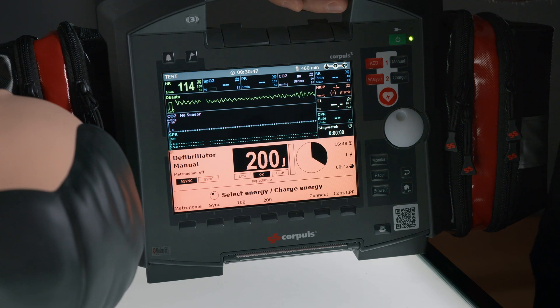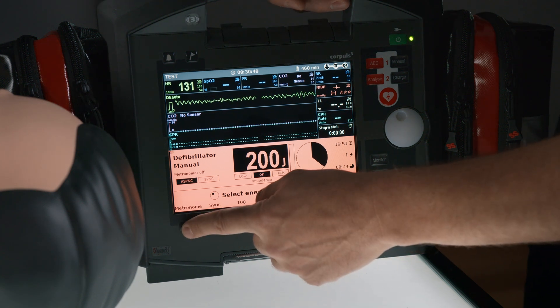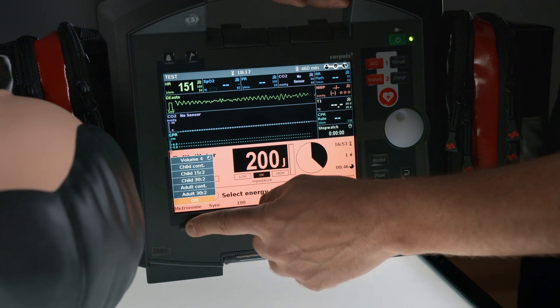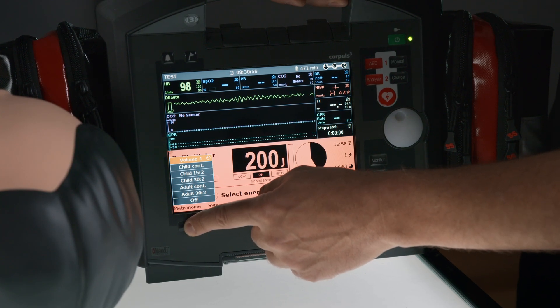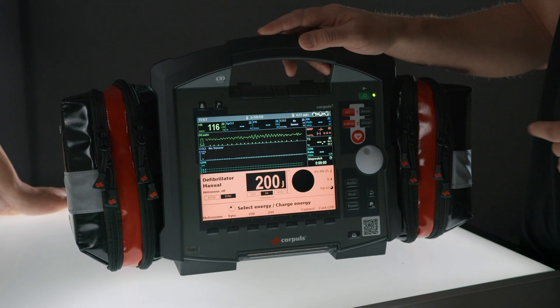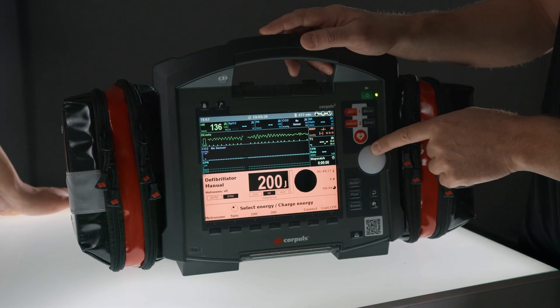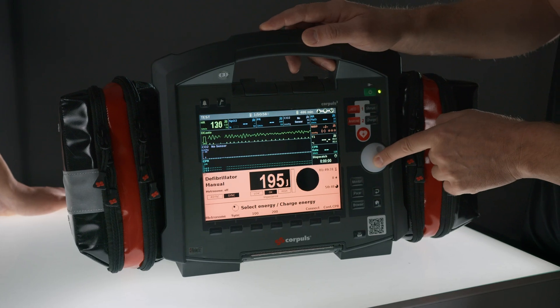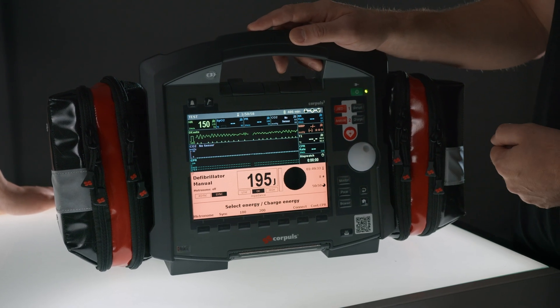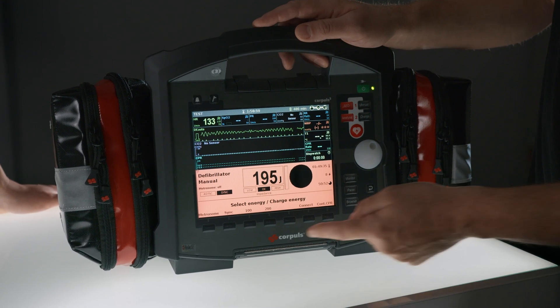With the soft key Metronome, you can turn the metronome on, turn it off, adjust the volume, or select one of the different modes available. As already mentioned, you have the option to change the energy setting with the jog dial. Once you've confirmed it and want to change it again, you need to press one of the two soft keys.